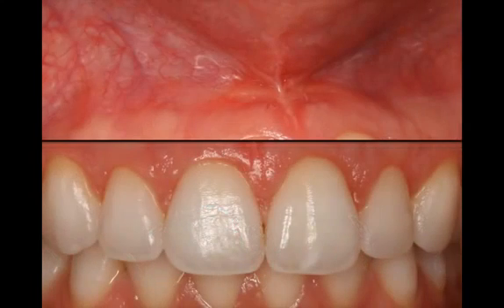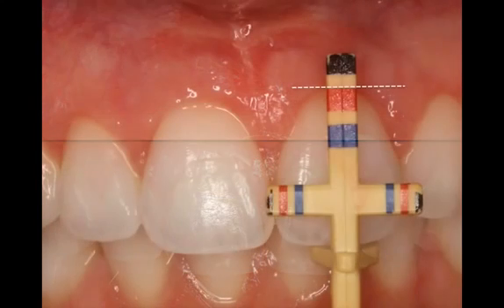And you see within a few weeks, the tissue will heal very, very nicely, and the frenum will present itself with a little scar tissue, and we know that this is not going to reattach again. So in this particular case, the patient healed very well with minimal side effects.